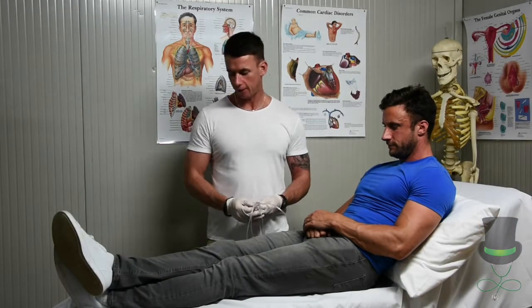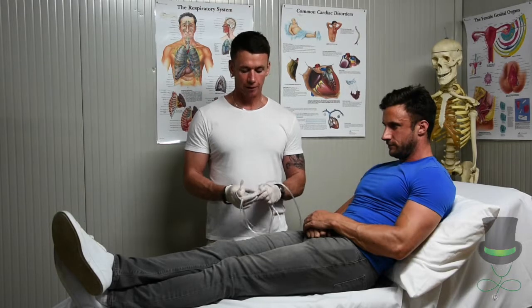Hi, I'm Anthony and I'm a paramedic and I'm going to demonstrate to you how to put on a nasal cannula.